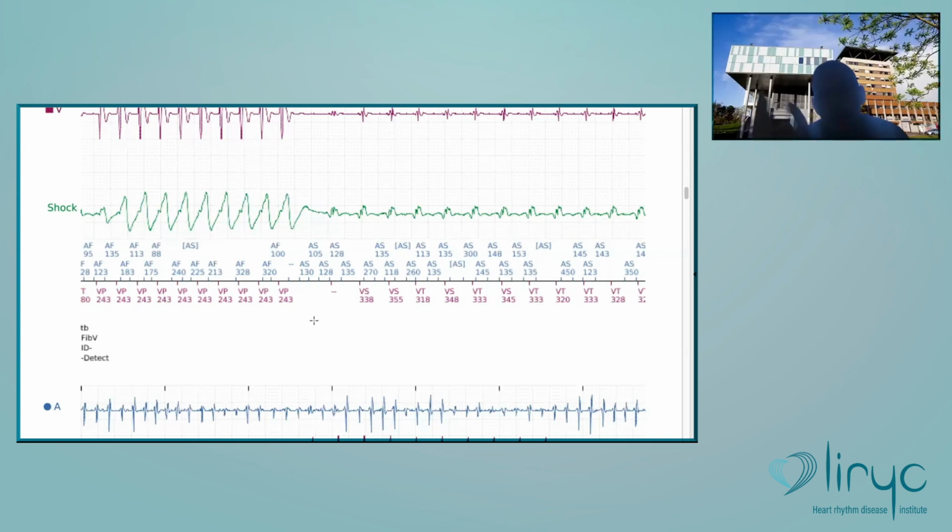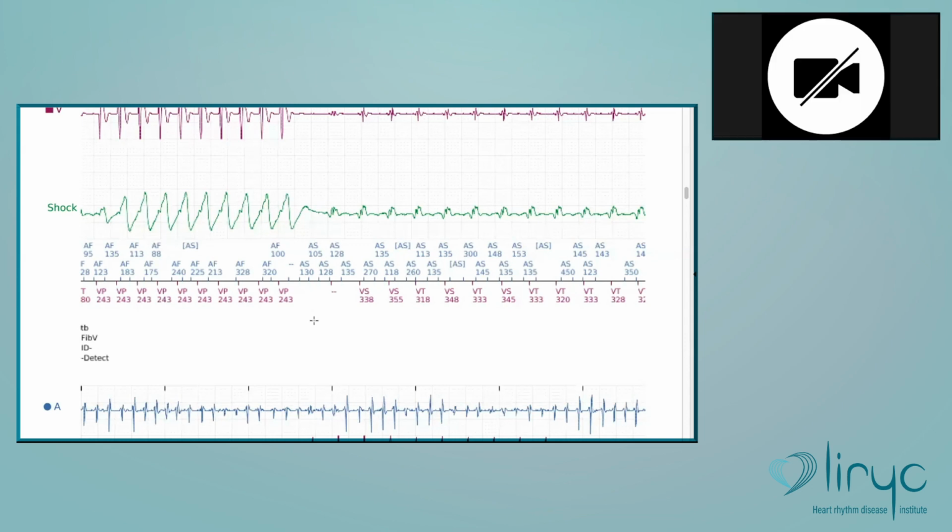In fact, it's too short. Most of the time after a burst, it depends on how you have programmed it. But sometimes you program a very short duration after a burst, and therefore there's not enough time for the analysis. Okay, I see. Okay.